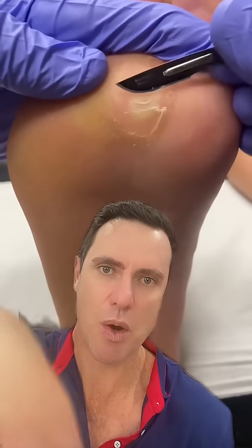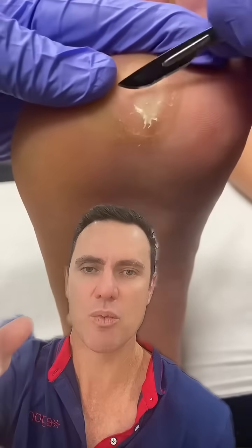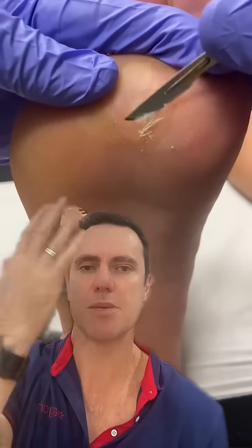We're now shaving into the corn section. What we're actually doing is shaving down as much as we can — you can see it's quite a wide corn section. We enucleate as much as we can as quickly and easily as possible, and then when we get right down to the pointy section we'll often use the tip of the scalpel, because we can't get further down without cutting the living tissue. We need to accurately cut out that central cone section.